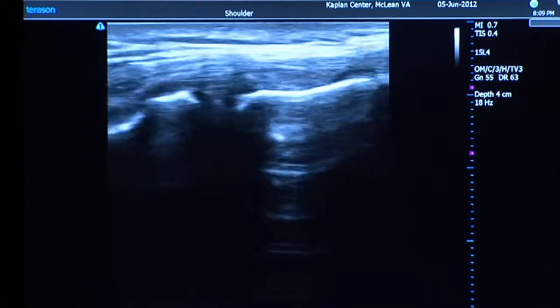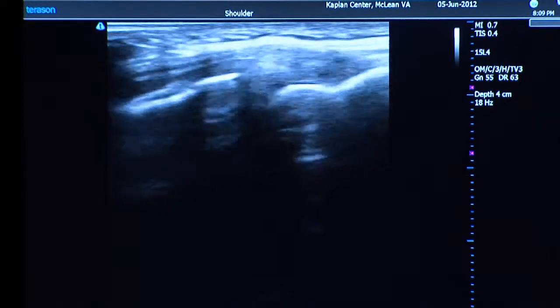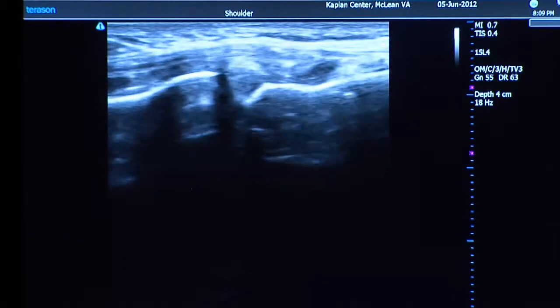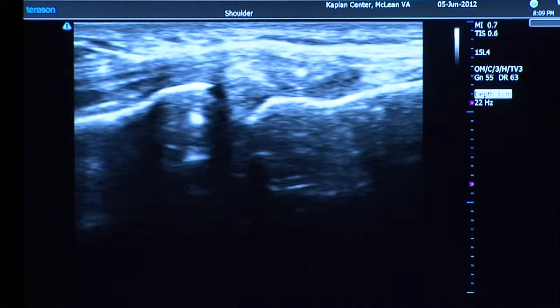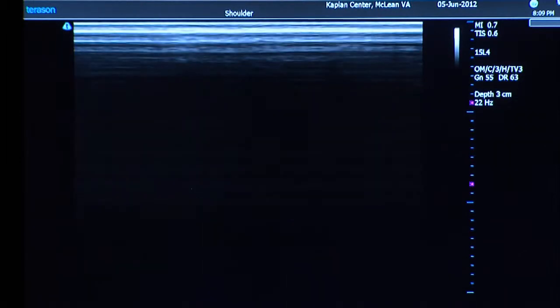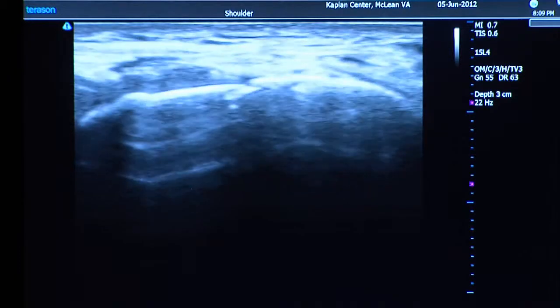Now here we see — a meniscal cyst. This is good; we're actually going to see something. I'm going to zoom in on this image to make it a little bit bigger, then pause it and point out what I'm looking at here.